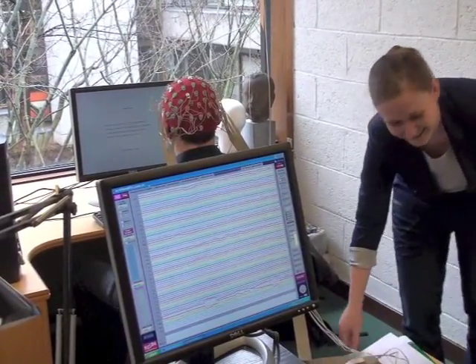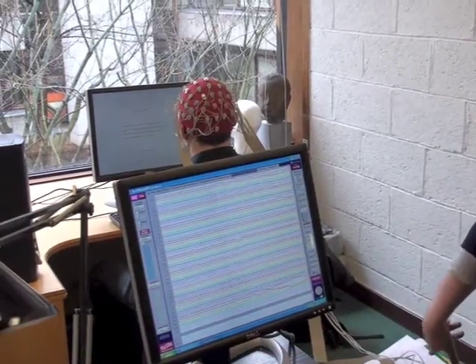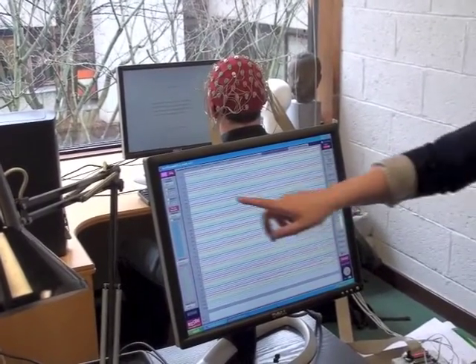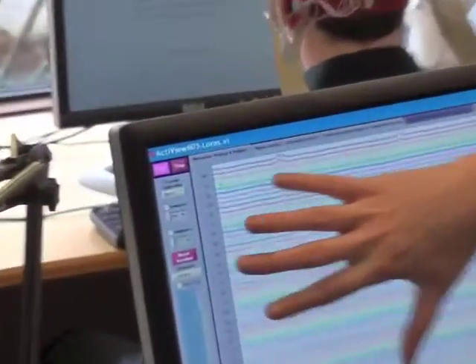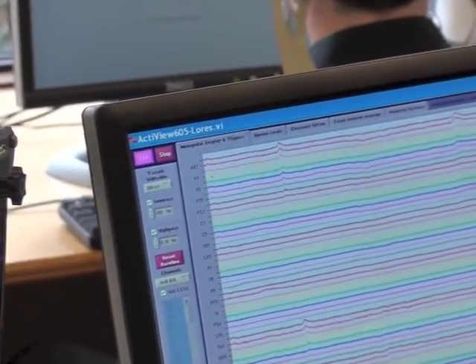Oh yes, the major thing I've forgotten to do, which is why it's really handy to have a checklist with you, I haven't started recording. So I shouldn't start the experiment yet. When I press start up here, it just starts showing me images from his head. It's not saving anywhere. You need the very bottom right here, which is start file. So I click on start file.